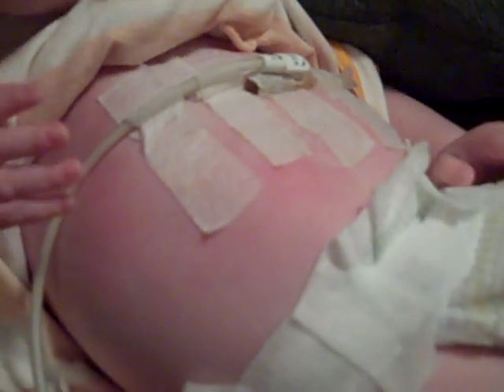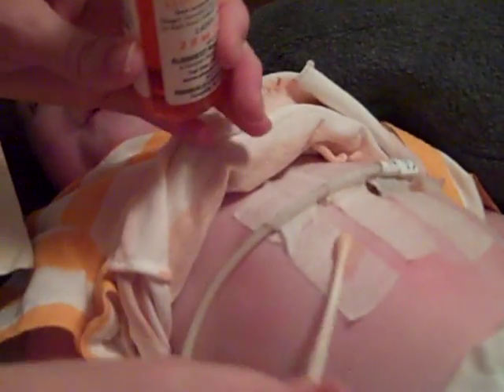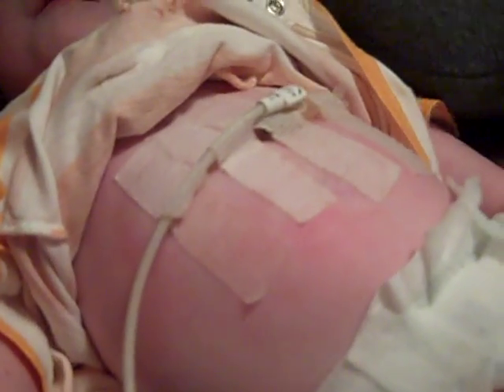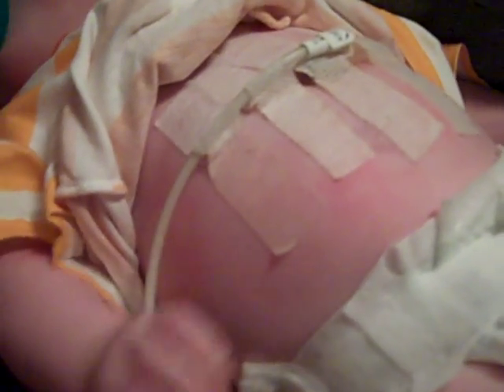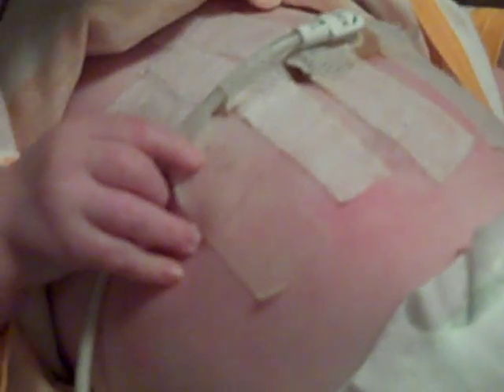is to get it on a Q-tip and go ahead and soak it so that it has some time to actually start taking that adhesive off. So this stuff is pretty greasy, and the best thing to do is not to leave it on the skin to actually take it off, because if you leave it on the skin, it actually can irritate it and make it red.